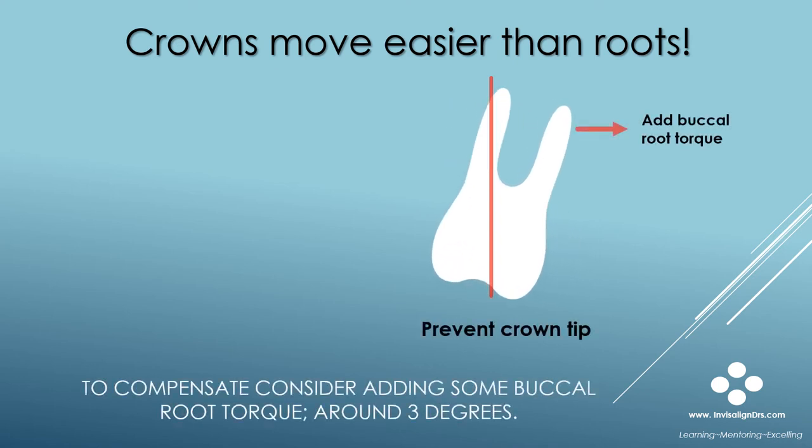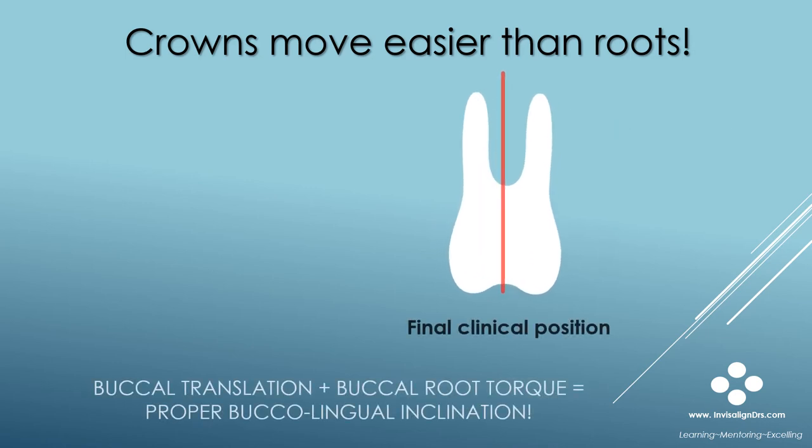To compensate for this undesirable effect, consider adding around 3 degrees of buccal root torque into your treatment plan. Here's the final position — no crown tip, because some buccal root torque was added to compensate.